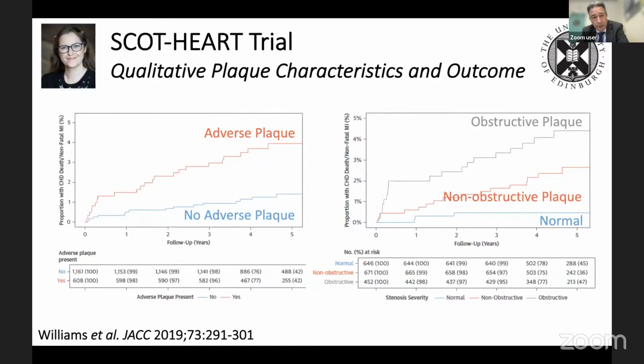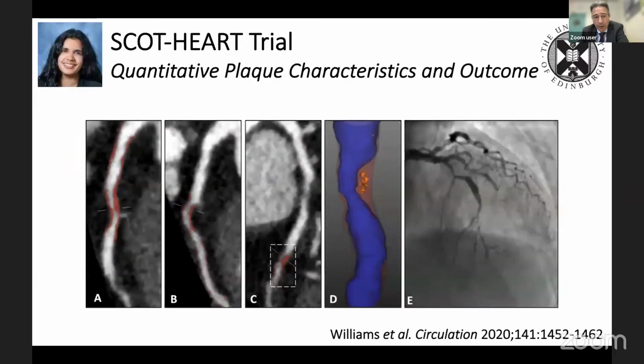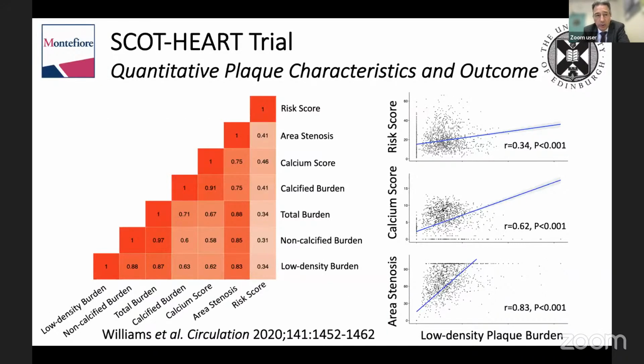Although it does beg the question, are you really going to go through every CT coronary angiogram and tirelessly characterize every plaque that's in the circulation? Perhaps a little bit challenging. But working with Damini Dey in Cedars in LA, Michelle and I got to use the AutoPlaque software. Of course, there are many different types of software, not just AutoPlaque, now available on the market, but just being able to characterize volumetrically the type, nature, and volume of the plaque, I think, is quite critical.